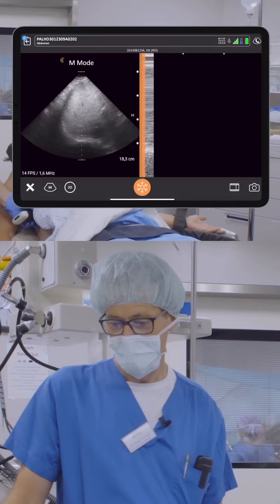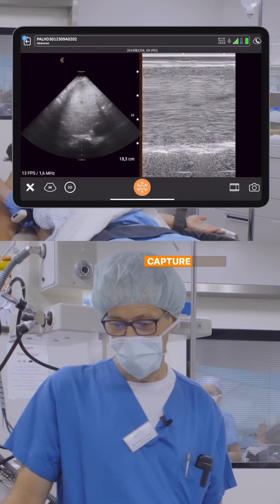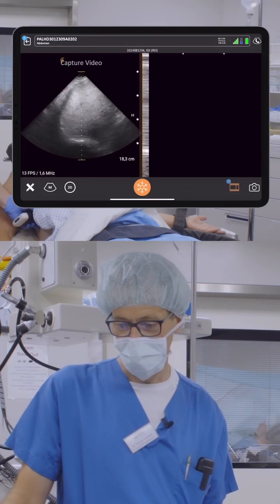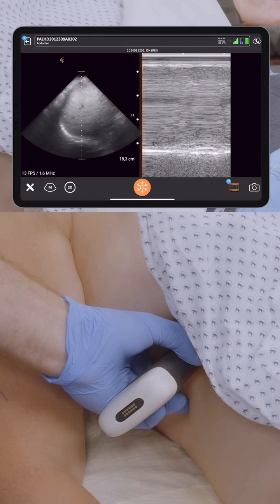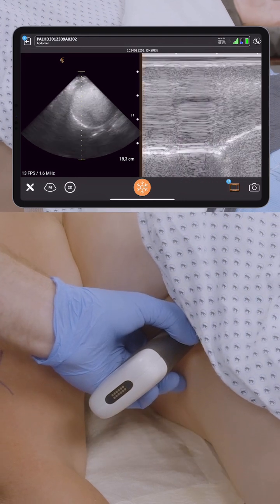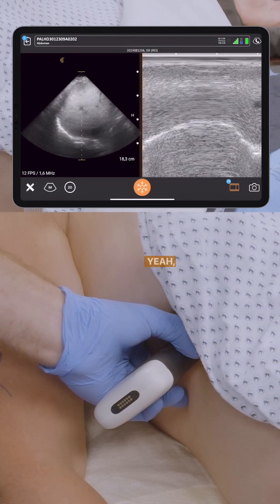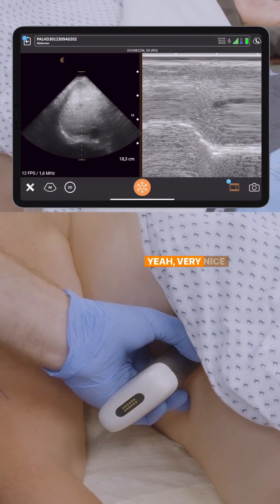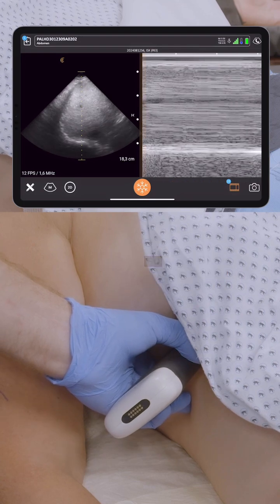M-Mode. Capture video. Now let's take a deep breath and breathe out. Very nice diaphragmatic function.